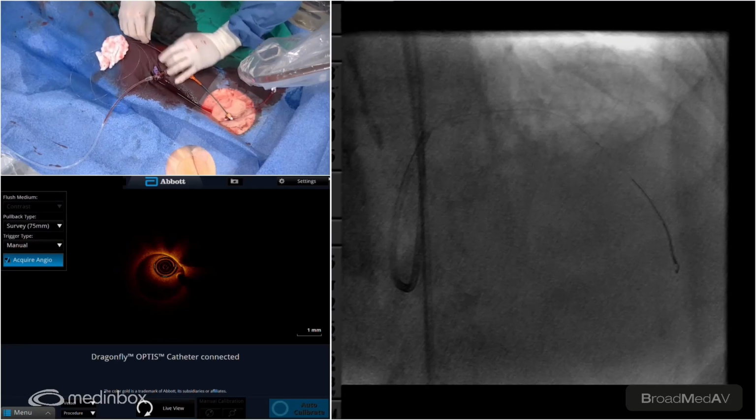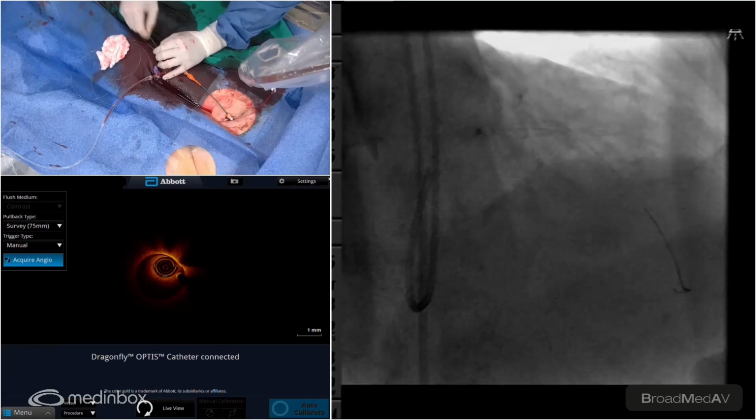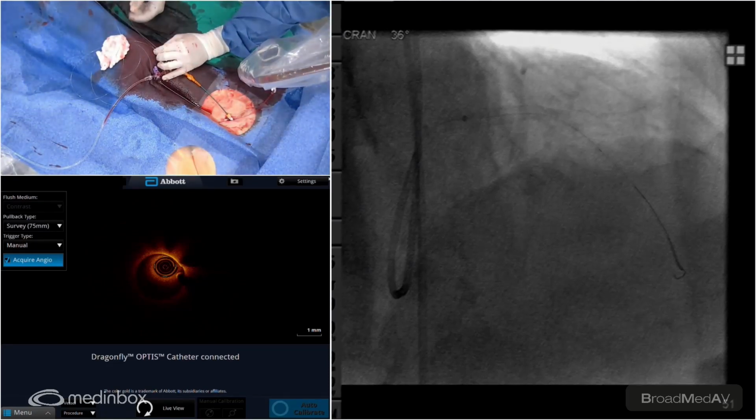Let's see how far this thing can go. Can it protect the proximal edge of it? Yeah, look at that. Oh, beautiful. I think we're good. Yeah, you should have the support past the RX point there. The RX has a bit of a kink in it after our previous pushes, but I'll be gentle with it. Let's see.